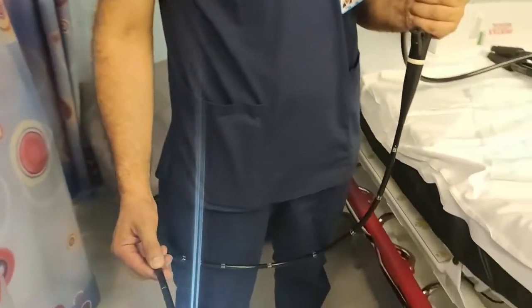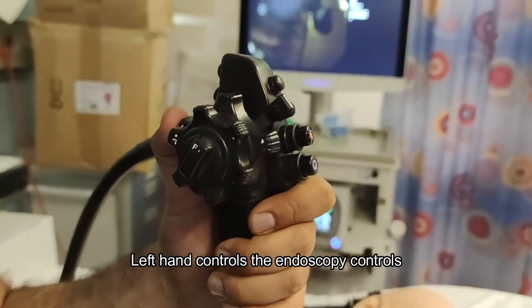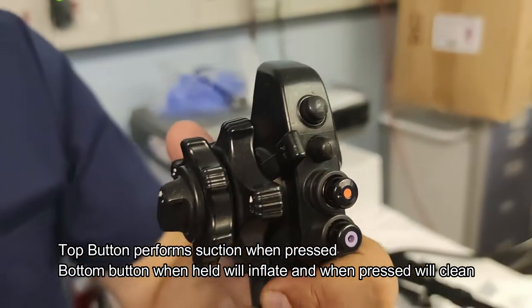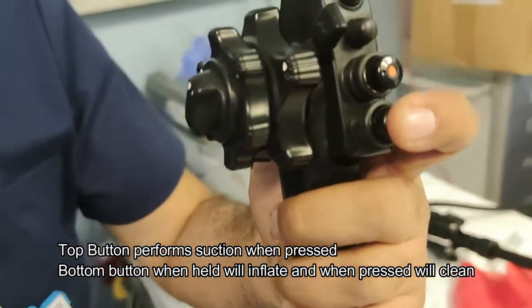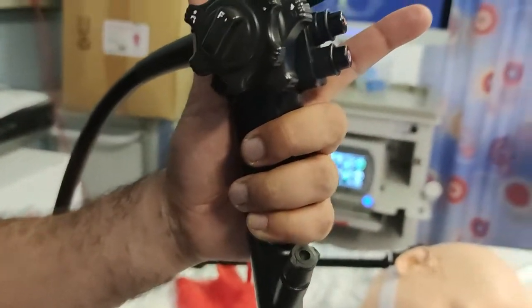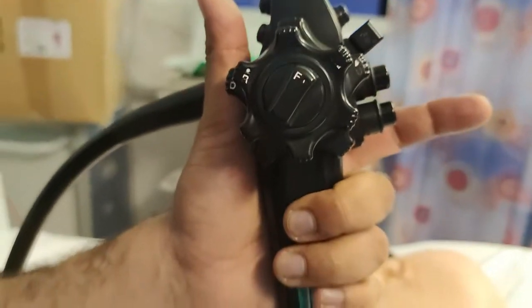The important things with the upper GI endoscopy: Hanbal's right hand is holding the scope and his left hand is holding the control wheels. The main buttons we will use are the one at the top, which does suctioning, and the one at the bottom which has a hole — when Hanbal holds this hole together it will inflate, and when he presses on it it will clean the lens. He is holding it with three fingers, with his second finger free to press on the buttons and his left thumb ready to use the big wheel.